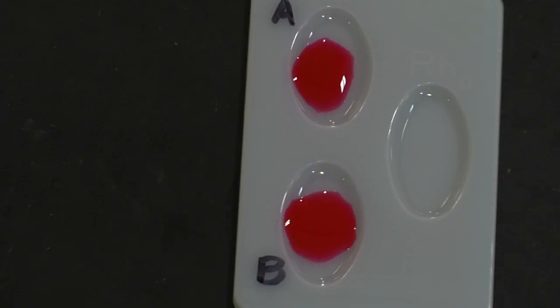Notice in both of these wells, nothing has happened. The blood sample does not contain A or B antigens. That tells us that this sample is from someone whose blood is in the O blood group.